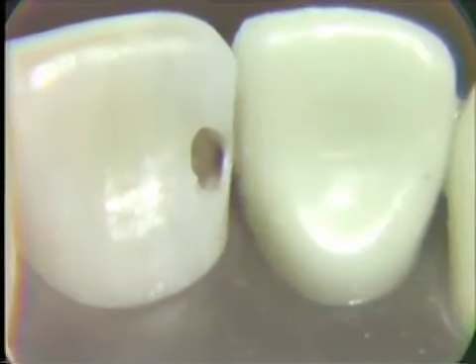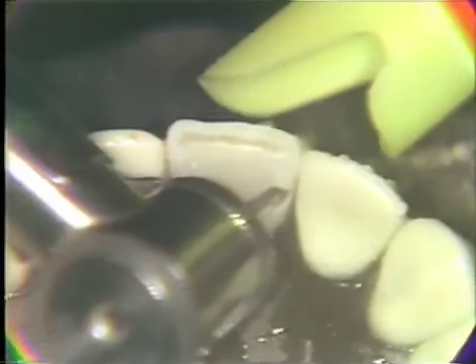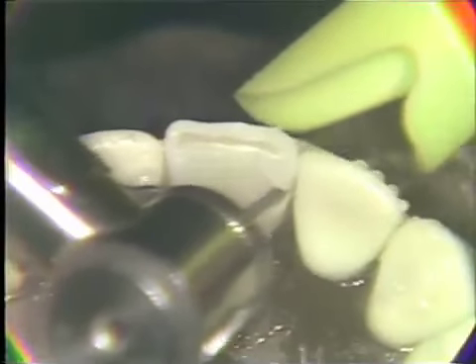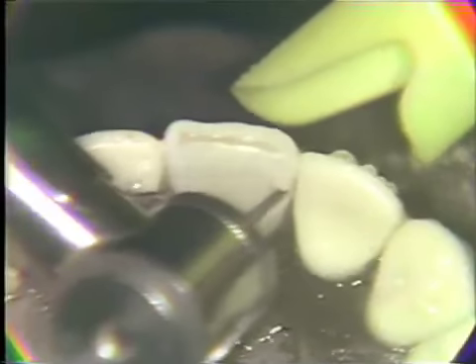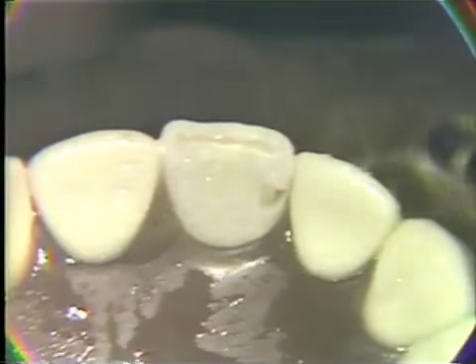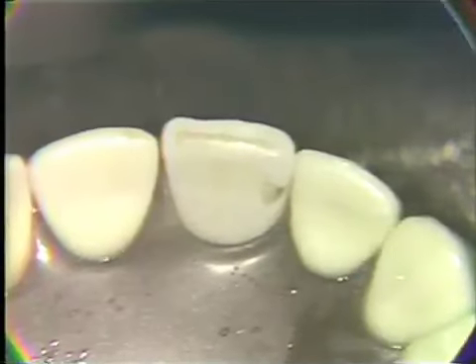So we'll carry out a bit more of the extension of the preparation. And stopping there and drying the area again.